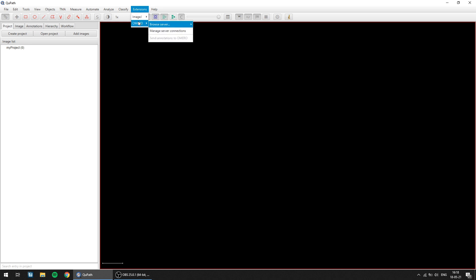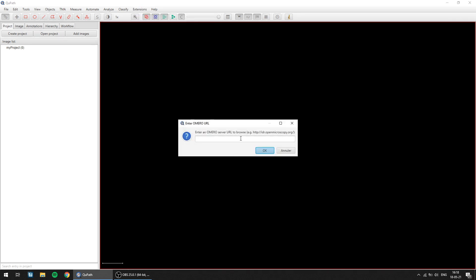So the main feature of the new Omero extension is a browser. The browser is accessible through Extension, Omero, Browse Server, New Server, and then here you can input the URL of the Omero server you'd like to browse.